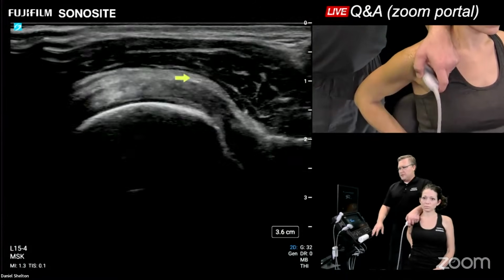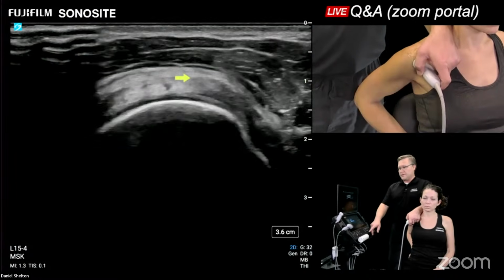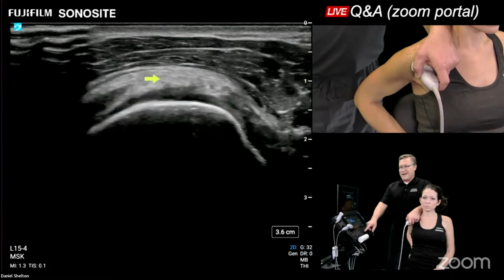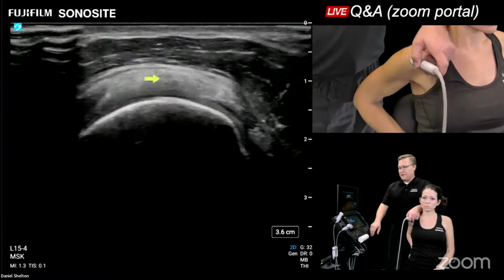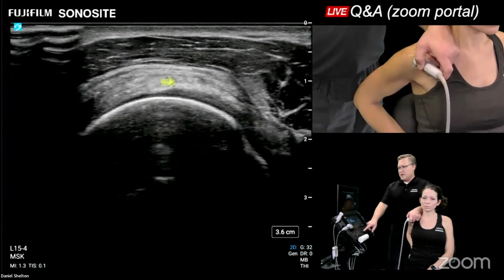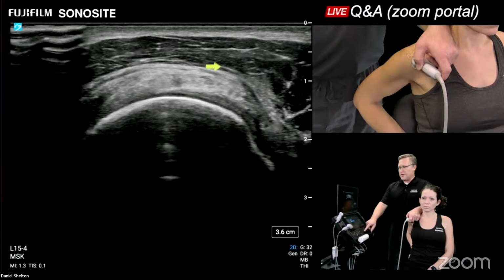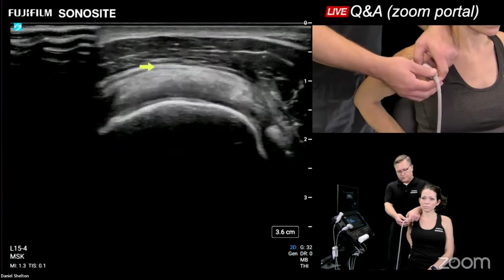But once you come out into this view, while the fibers are stretched tight, this is where you're most likely going to see what I would call a flat tire. It's commonly called that at a lot of the programs that you go to, but you would see this wheel look the same, but then we would have this huge divot. This deltoid would herniate into the tendon on its own.